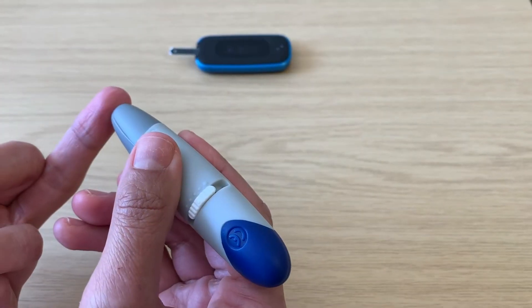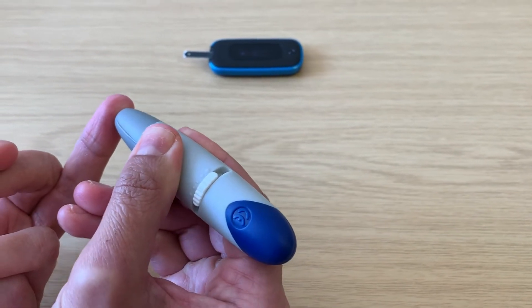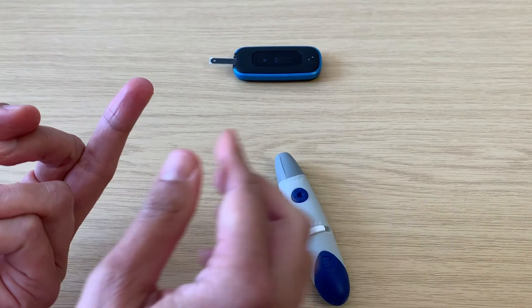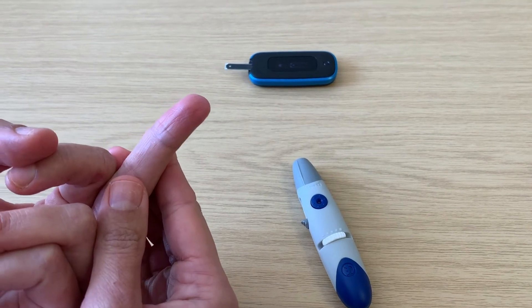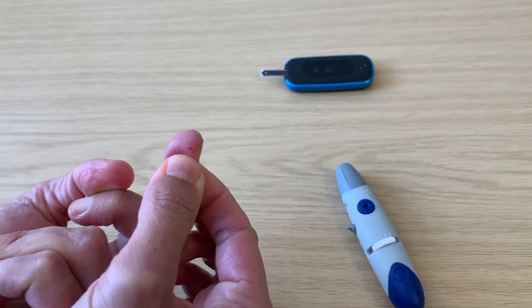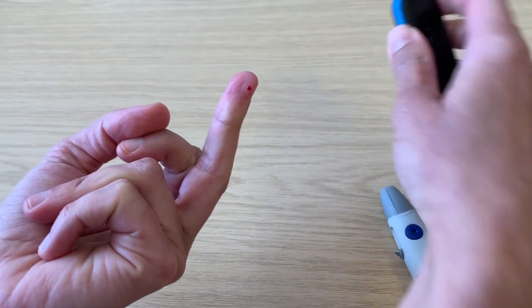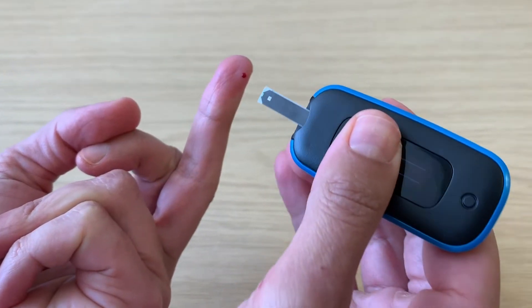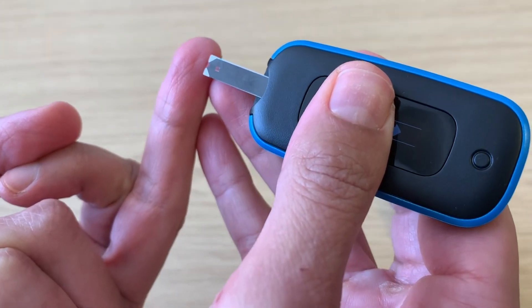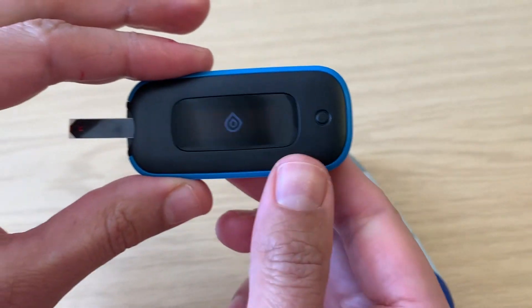Place the lancing device against your finger and press the round blue button. To ensure you get enough blood, rub the finger from the base upwards. Place the end of the strip onto the blood. It will suck up a small amount and then display the blood glucose reading.